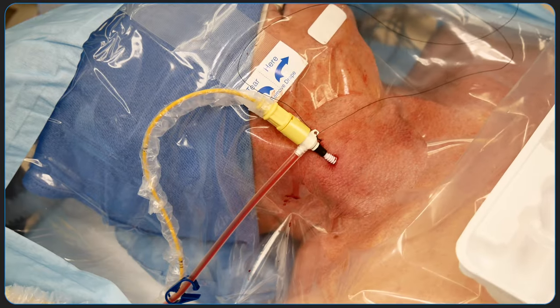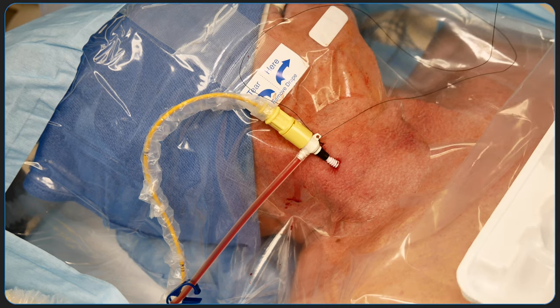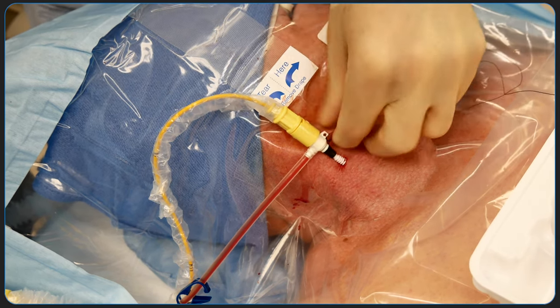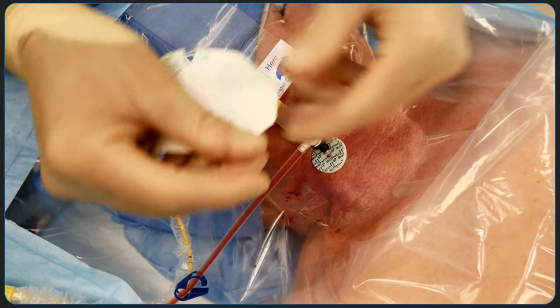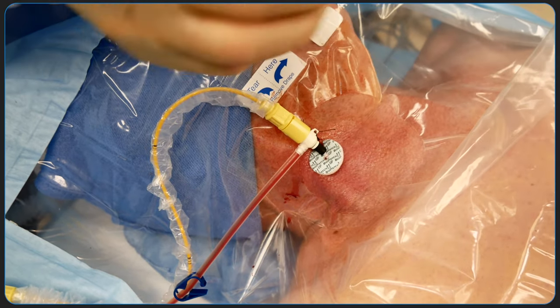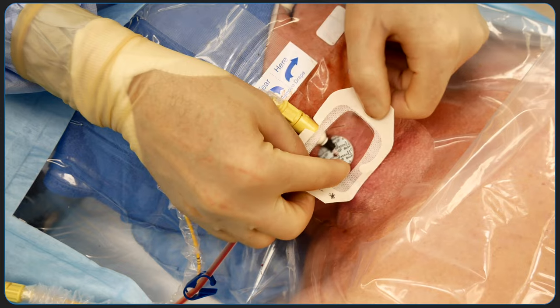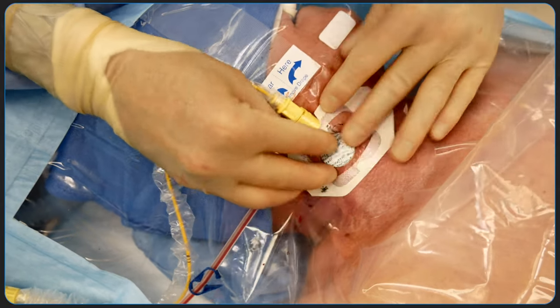With the pulmonary artery catheter in the correct location, the catheter assembly is locked and the introducer is sutured to secure the line. An adhesive such as Mastisol may be used to secure the dressing. A Biopatch is then placed in addition to a Tegaderm.